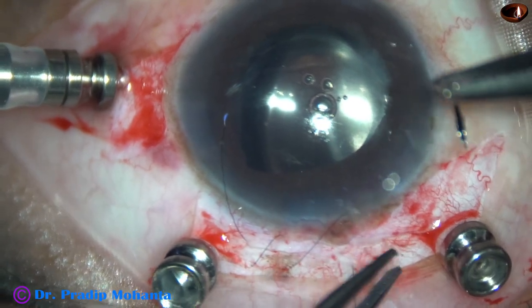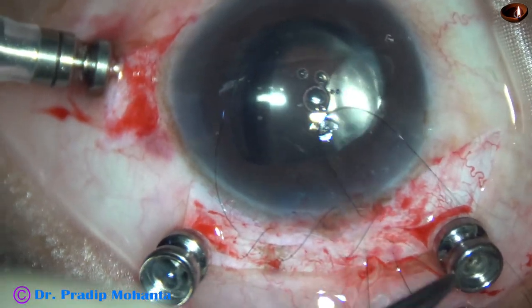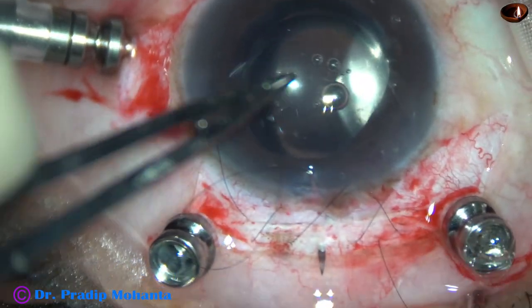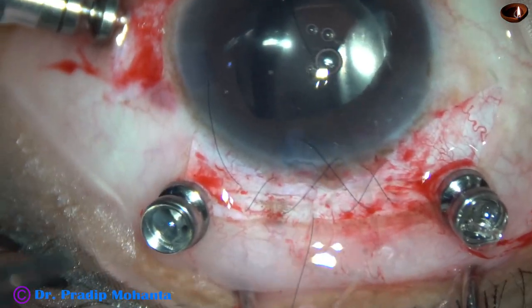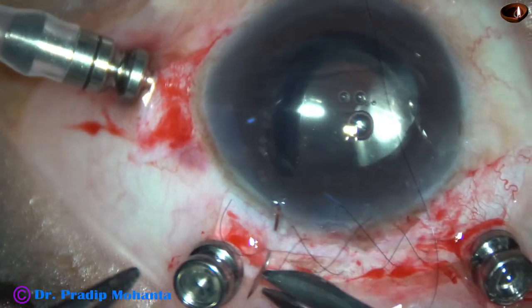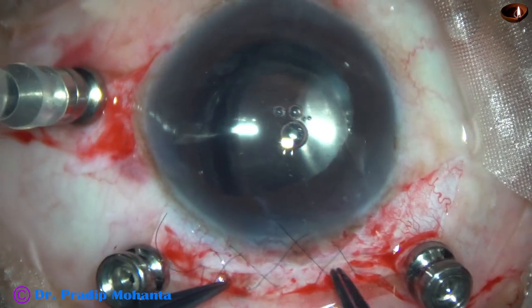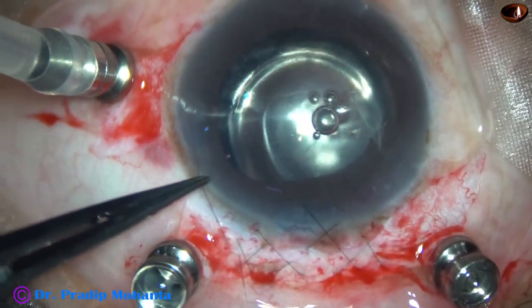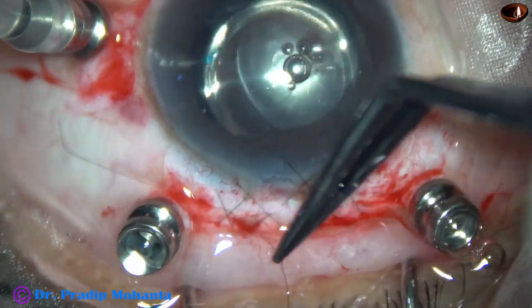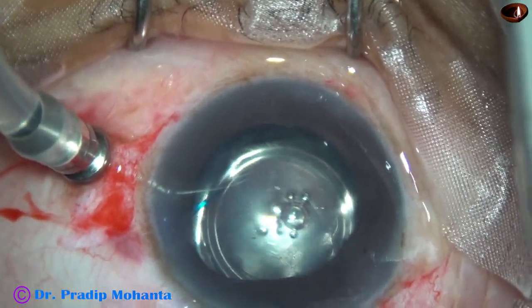I used an air bubble to maintain the contour of the eyeball. I did not use irrigation because if I use irrigation the intraocular pressure becomes very high, and suturing the wound takes some time. The surgery is now at four times normal speed. This is the last bite — the knot is going to be buried in the sclera. Pull the threads, and you can see that the knot is going into the sclera. Trim the threads near the knot.